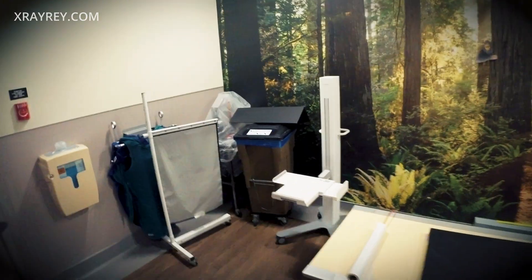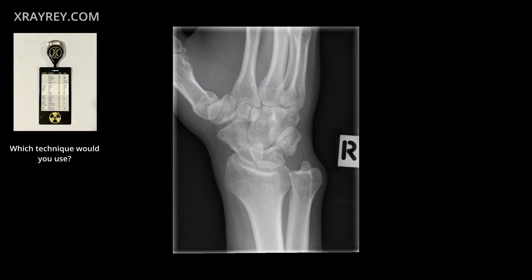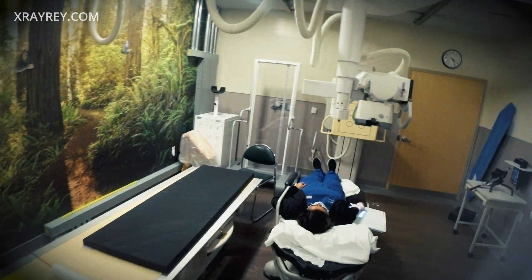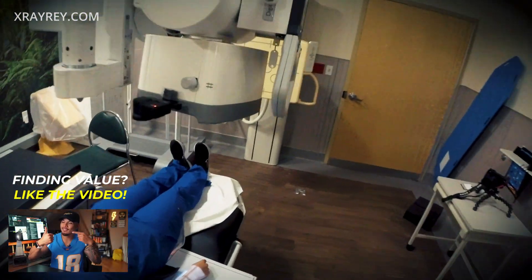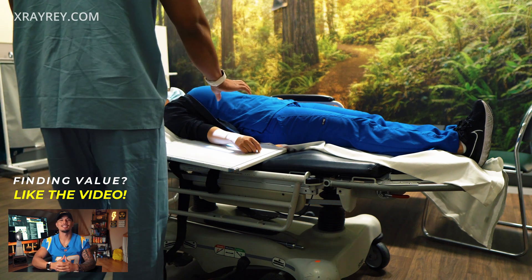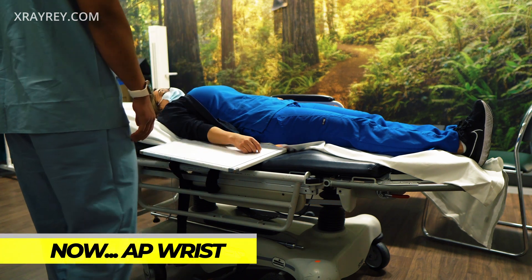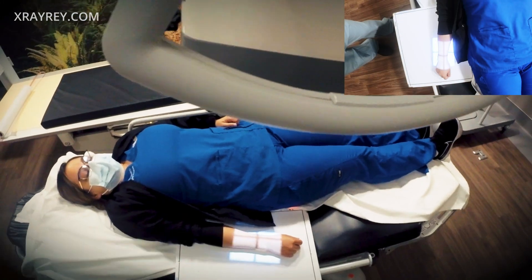Hold still. Okay, so are you able to turn your wrist at all to the left? No? Okay, all right. Hmm, let's see here.